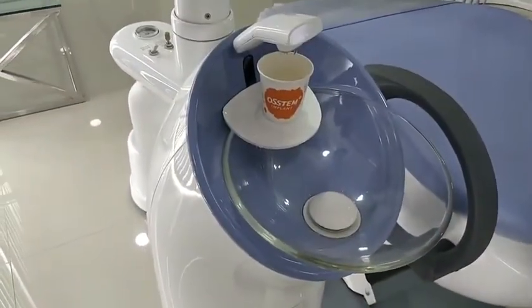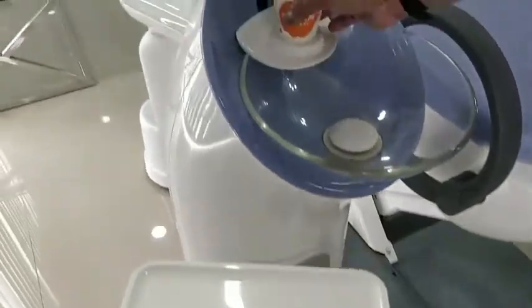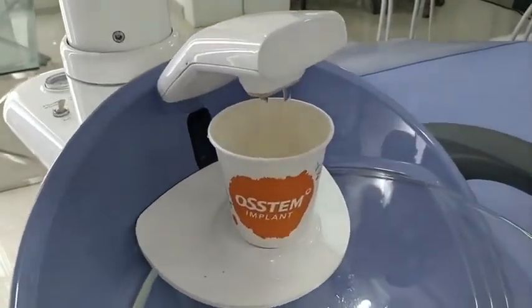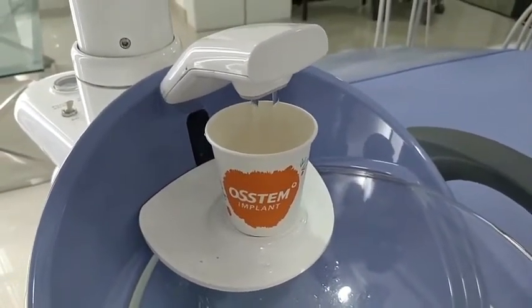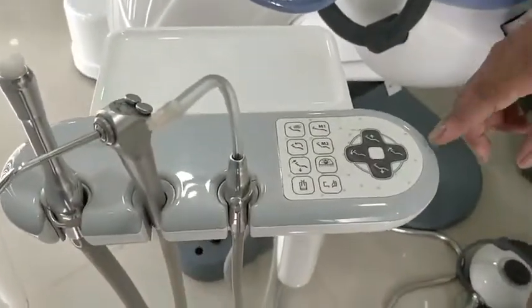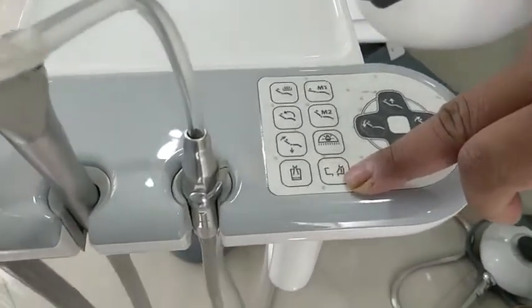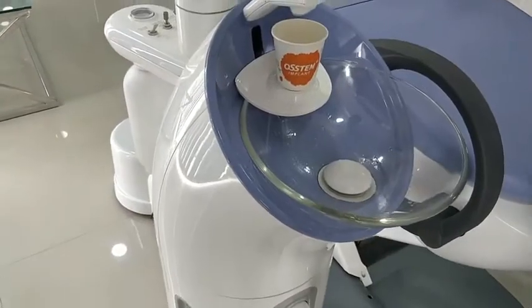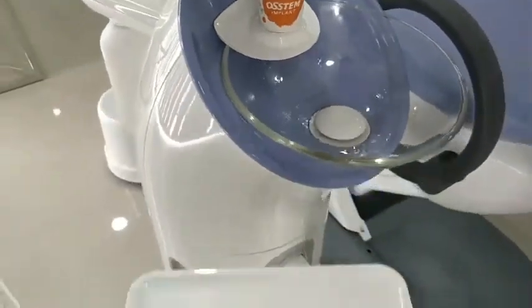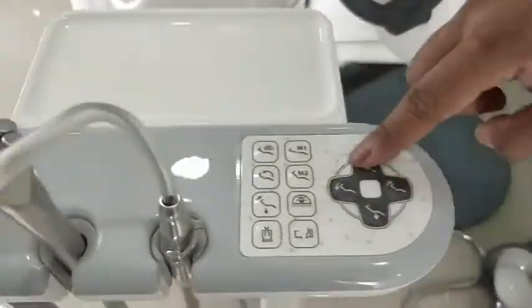The last two buttons control the water level. One button fills the glass — you can see the glass filling up. Another feature is automatic glass filling: when you place the glass in the spittoon, a sensor detects it and automatically fills the glass to a set level. There is also a spittoon rinse button and a joystick for chair position adjustment.